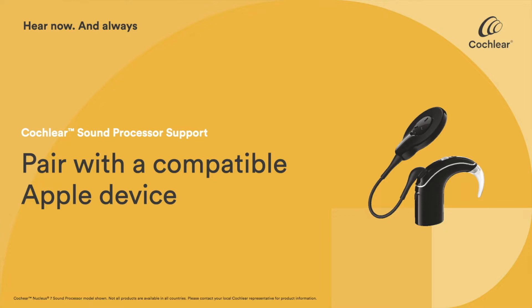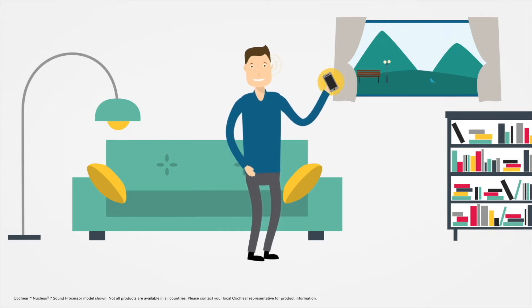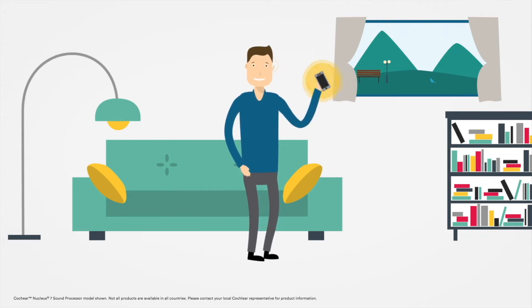To start using the Nucleus Smart App's control and monitoring features, you'll need to pair your sound processor with your compatible Apple device.